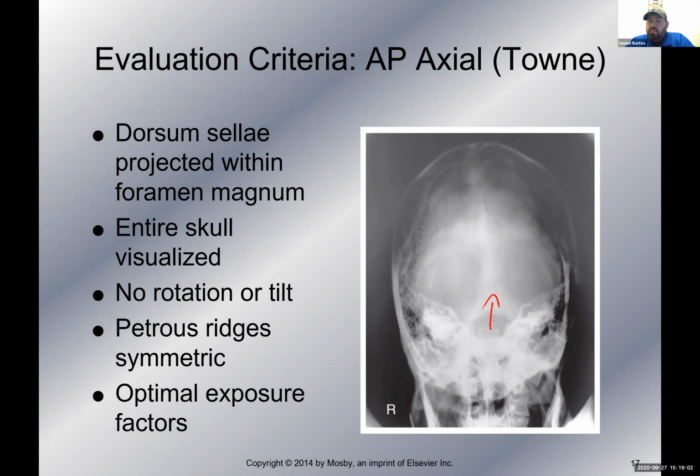So what do you need to do? Either you need to increase the angle between the CR and the OML, or you need to increase the flexion of the patient. Now, obviously, we can't increase flexion, so we would increase the angle. Now, the problem you get with trying to increase the angle is you cannot exceed what degrees? 45 degrees. Right? If you go over that, the image is no good.